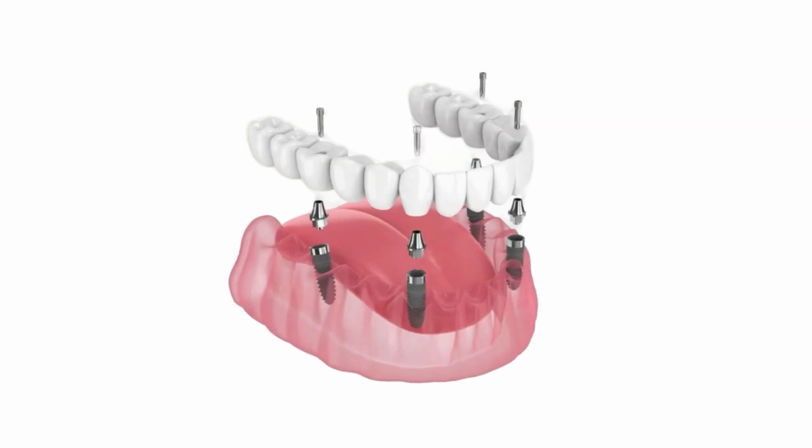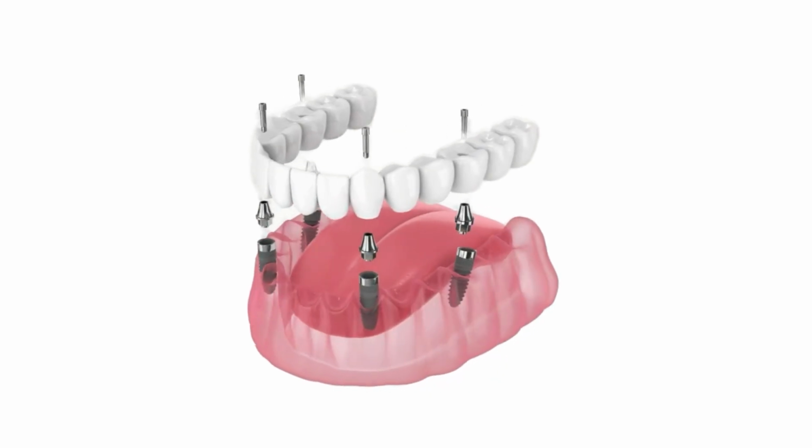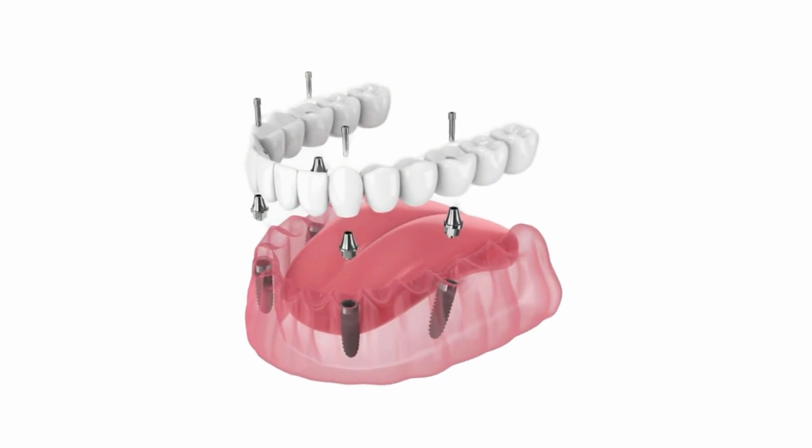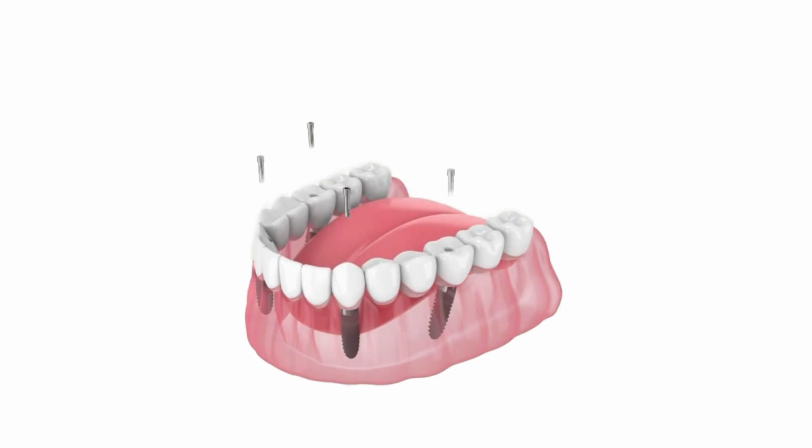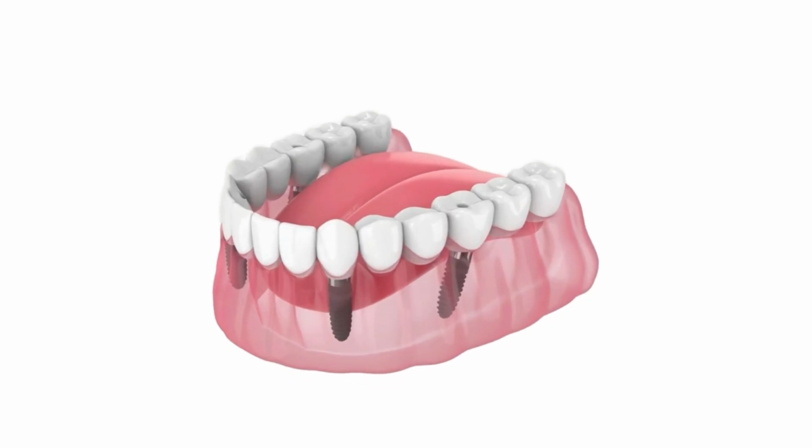So All-on-X is a very straightforward procedure nowadays because it allows the patient to have a fixed prosthesis on an X amount of implants, right? So how do we pick the number of implants?